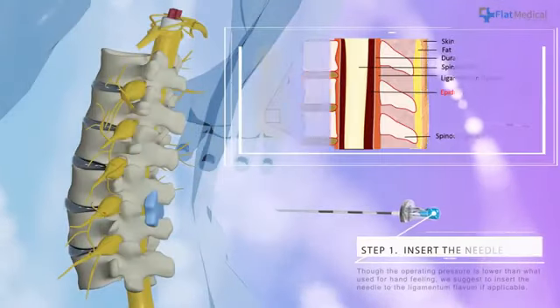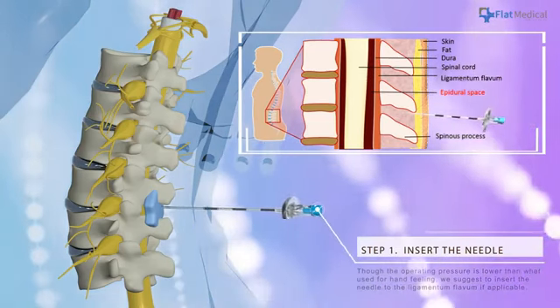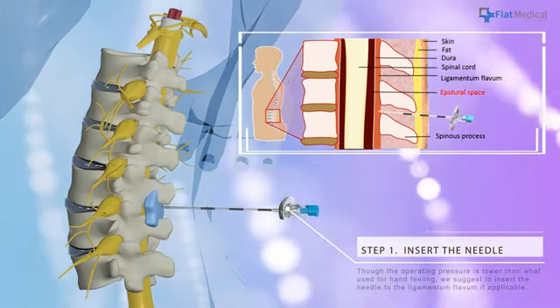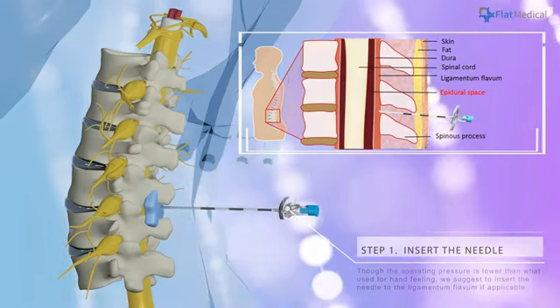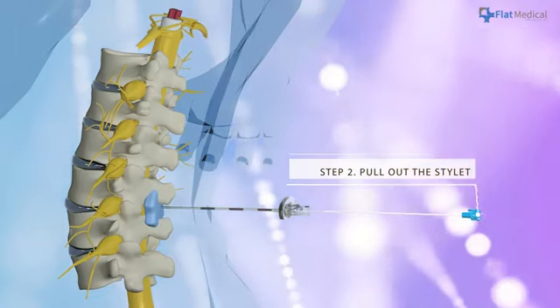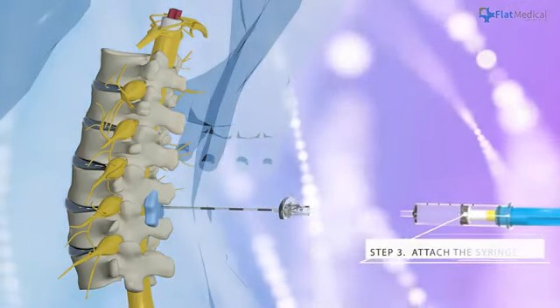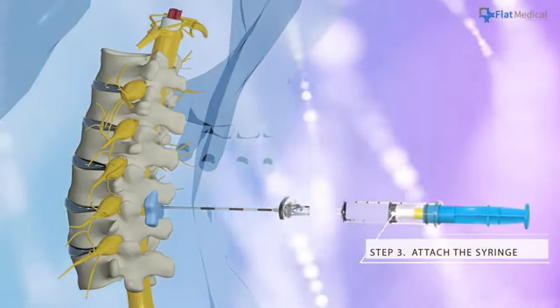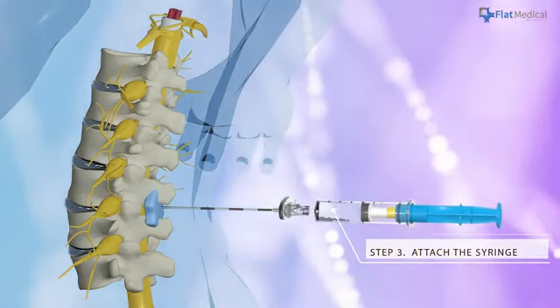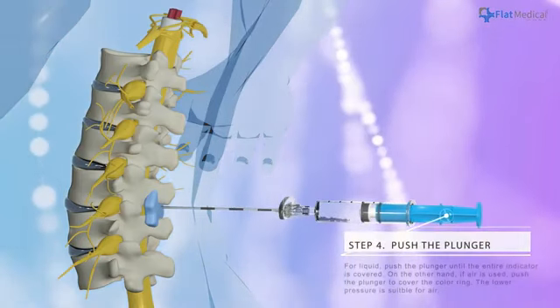Insert the epidural needle. Though the operating pressure is lower than what is used for hand feeling, we suggest inserting the needle to the ligamentum flavum if applicable. After the needle is inserted to the appropriate depth, withdraw the stylet and attach the Epiphaeth syringe to the needle hub.